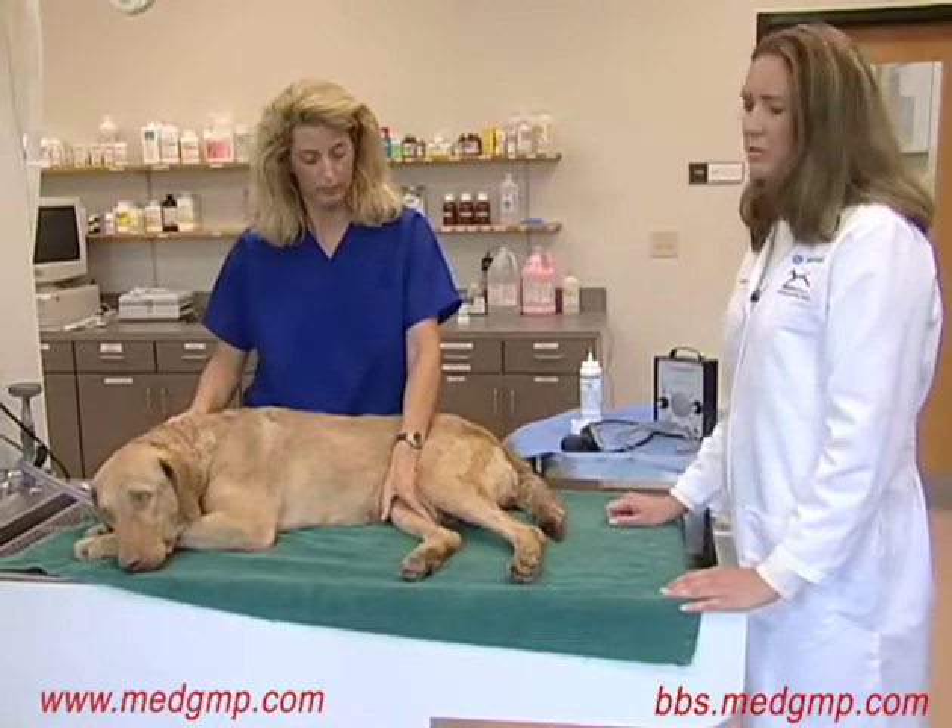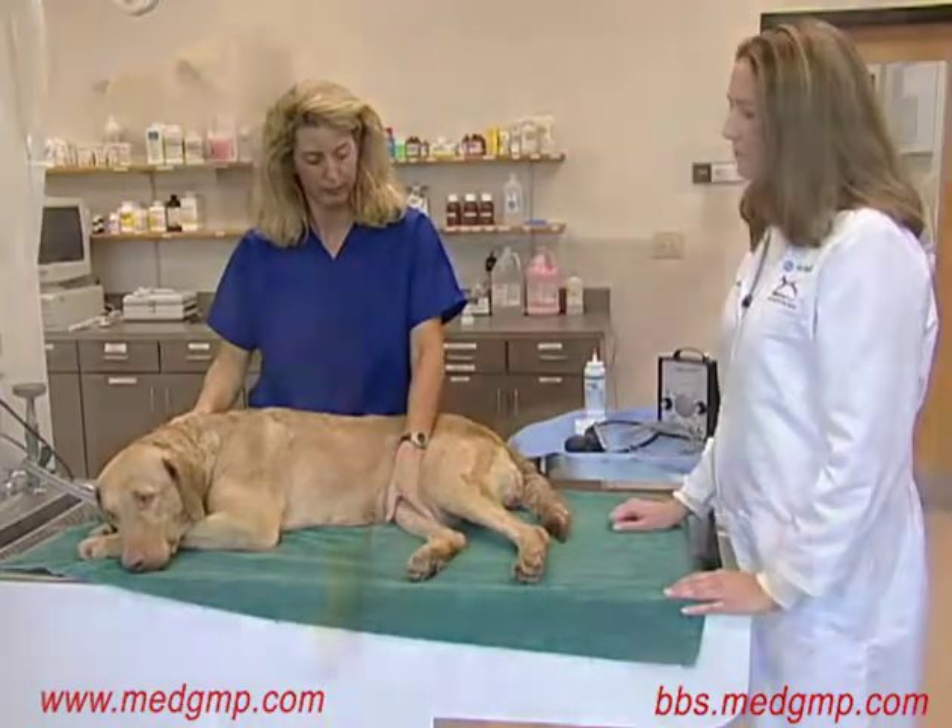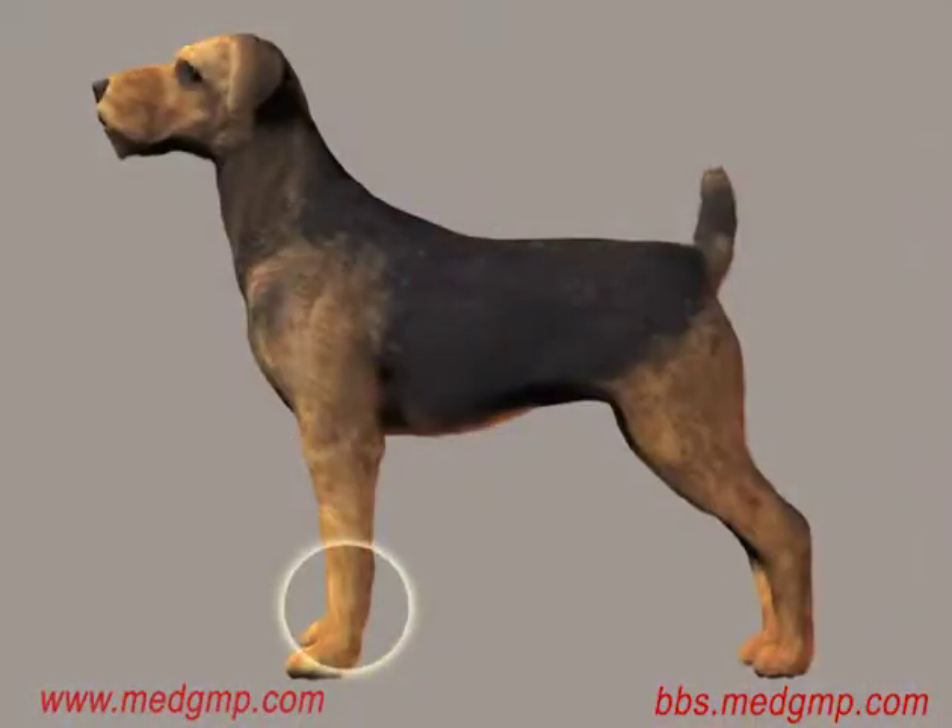There are numerous spots from where you can measure blood pressure. One spot would be the metacarpal artery, the metatarsal, the dorsal pedal, and the median coccygeal.